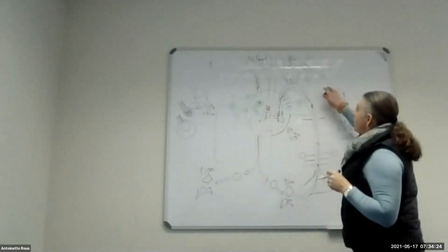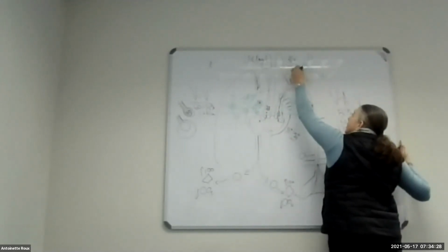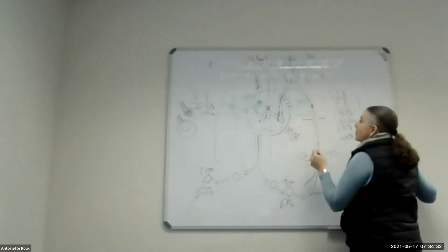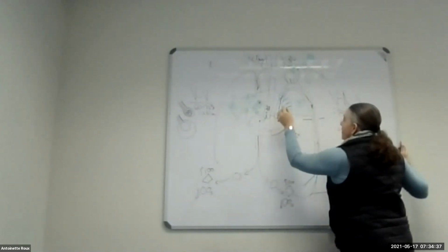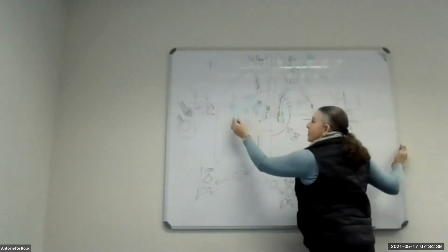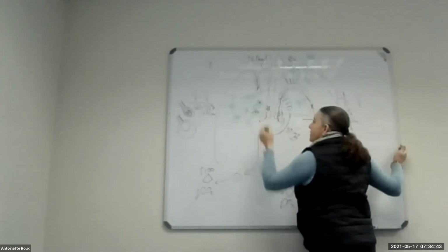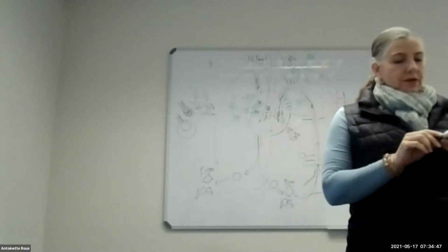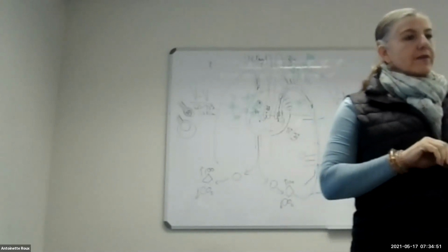When we get ARDS patients, they normally come in with a 75% SaO2. So that means they're already in a deficit. They've lost 1 oxygen molecule because the alveoli aren't working properly. So this carries on here. The same happens. They also lose 1 oxygen molecule, and we will start off with about a 50% SVO2 in those patients. So SVO2 is a very important thing to look at when your patients are on ECMO.